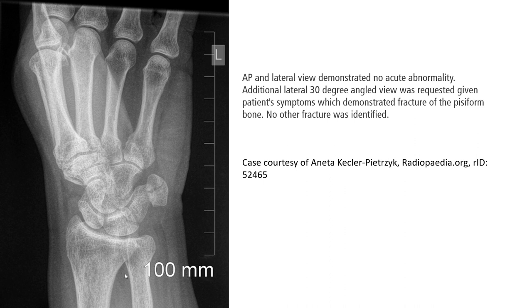This is an image of the additional lateral 30 degree supination angle. We can see a faint lucency line across the pisiform. This is the pisiform fracture case.